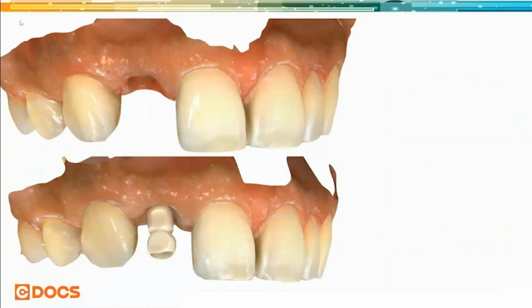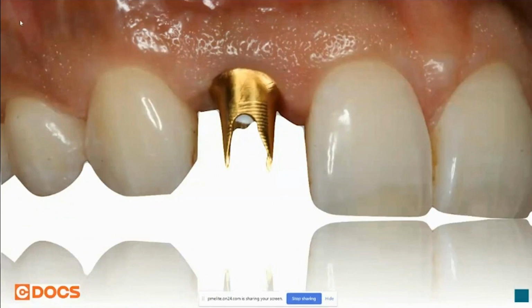And so in my practice, the way this workflow works is we scan with the IO-Flow post, Atlantis, we ask them for the custom abutment, and we also ask them for a guide, the transfer jig that helps align the custom abutment. The custom abutment's placed. It looks like this. So in the anterior, Atlantis has gold-plated titanium for aesthetics, and the posterior, obviously standard titanium.